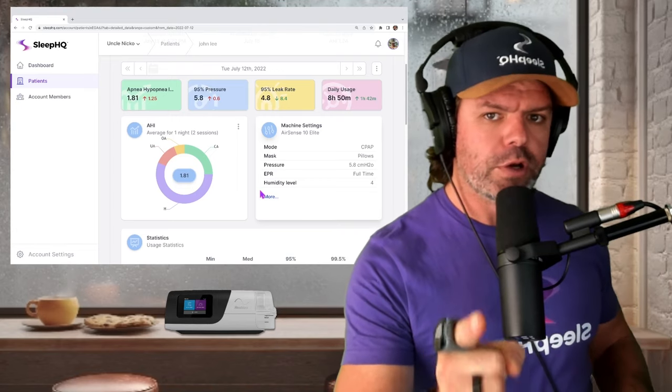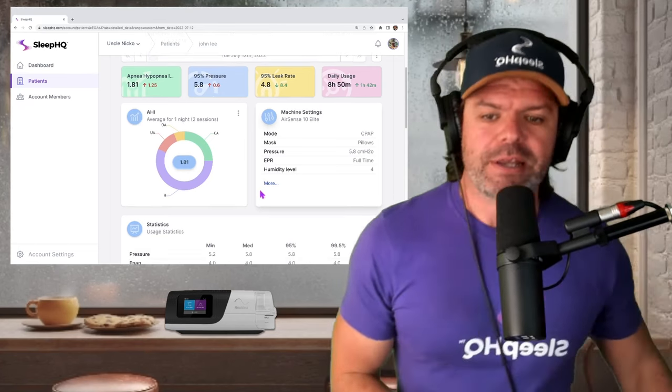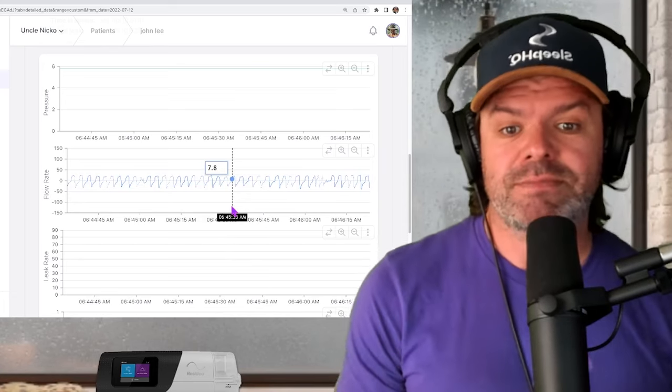We have all the information we need to make good treatment decisions. Let's scroll down and check out John's breathing on the flow rate. I'm going to click and drag to zoom in. Hmm — very interesting, doesn't look too bad, relatively stable. Now on this occasion the AHI calculation was relatively accurate, but that doesn't necessarily mean there's adequate airflow to maintain stable oxygen levels. I'm scrolling down to this little pink line here called flow limitation.